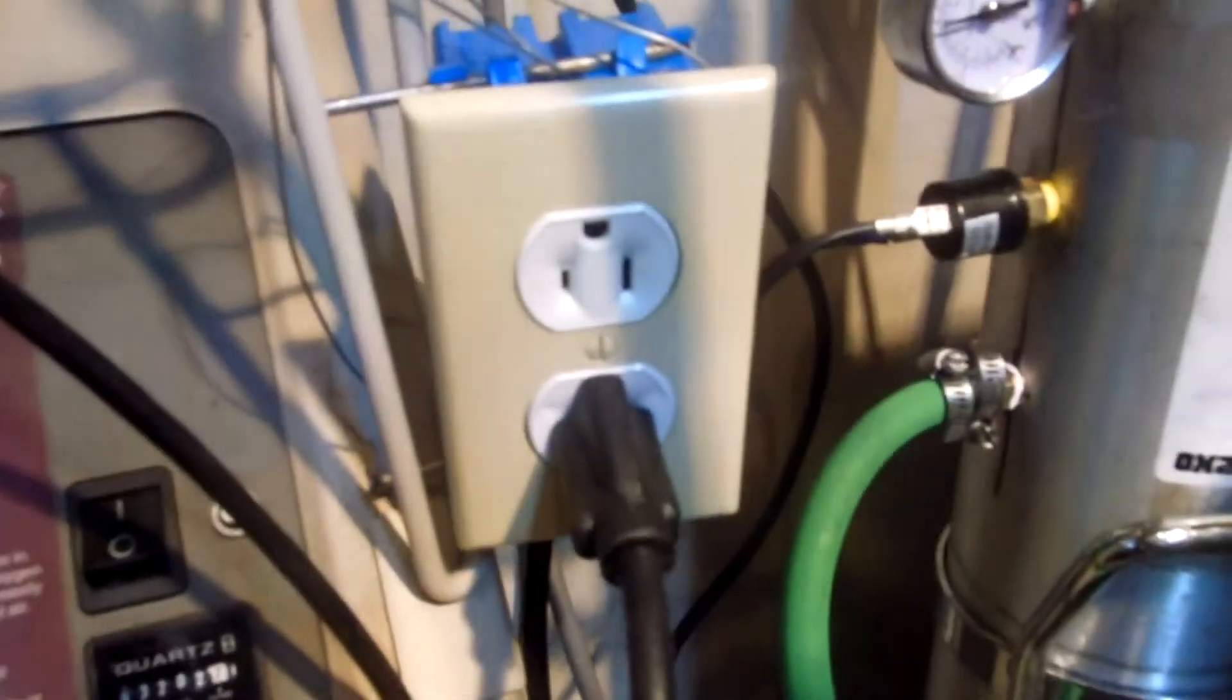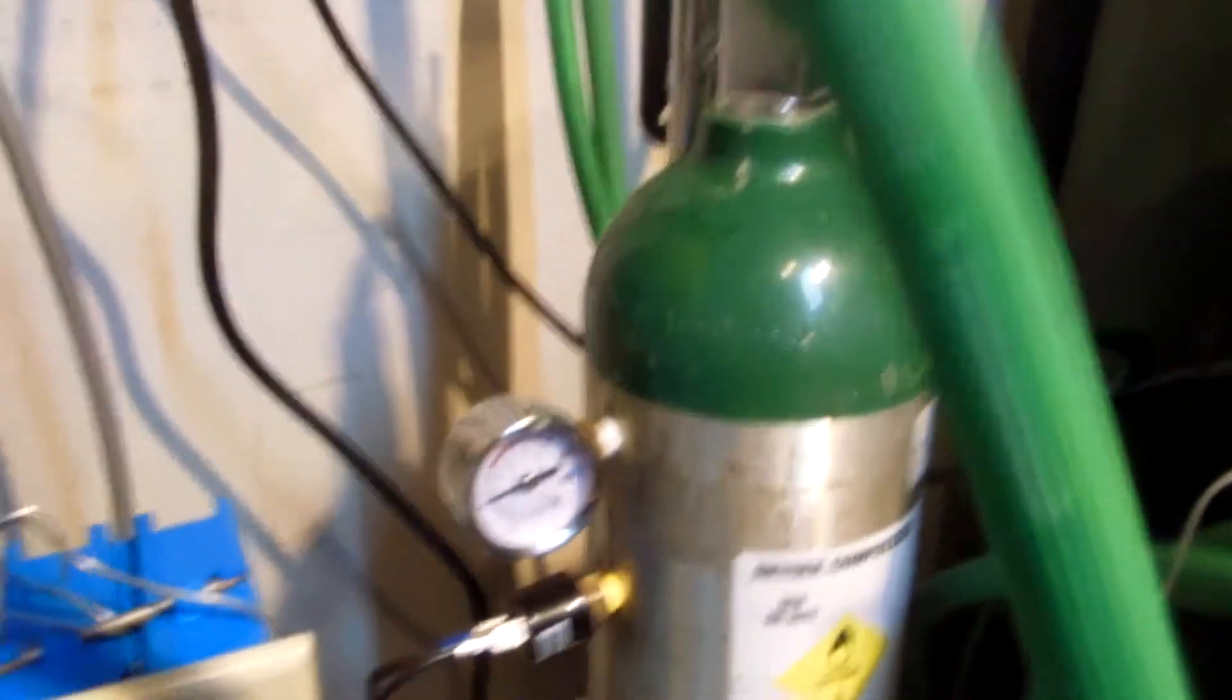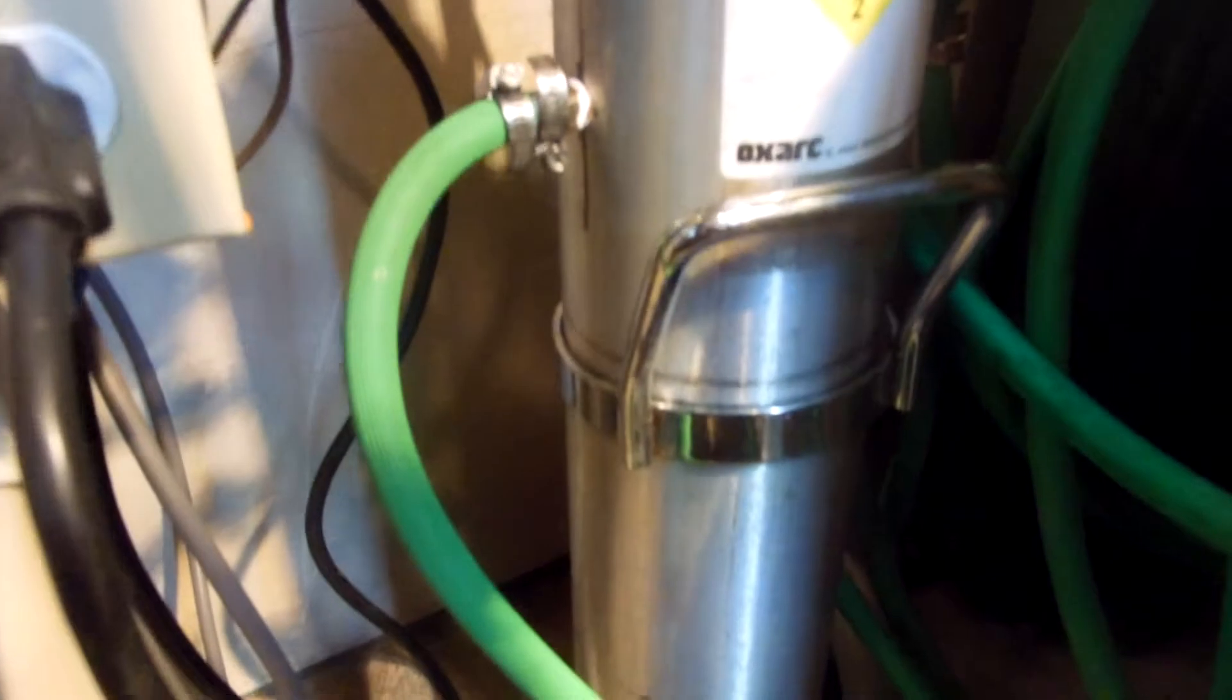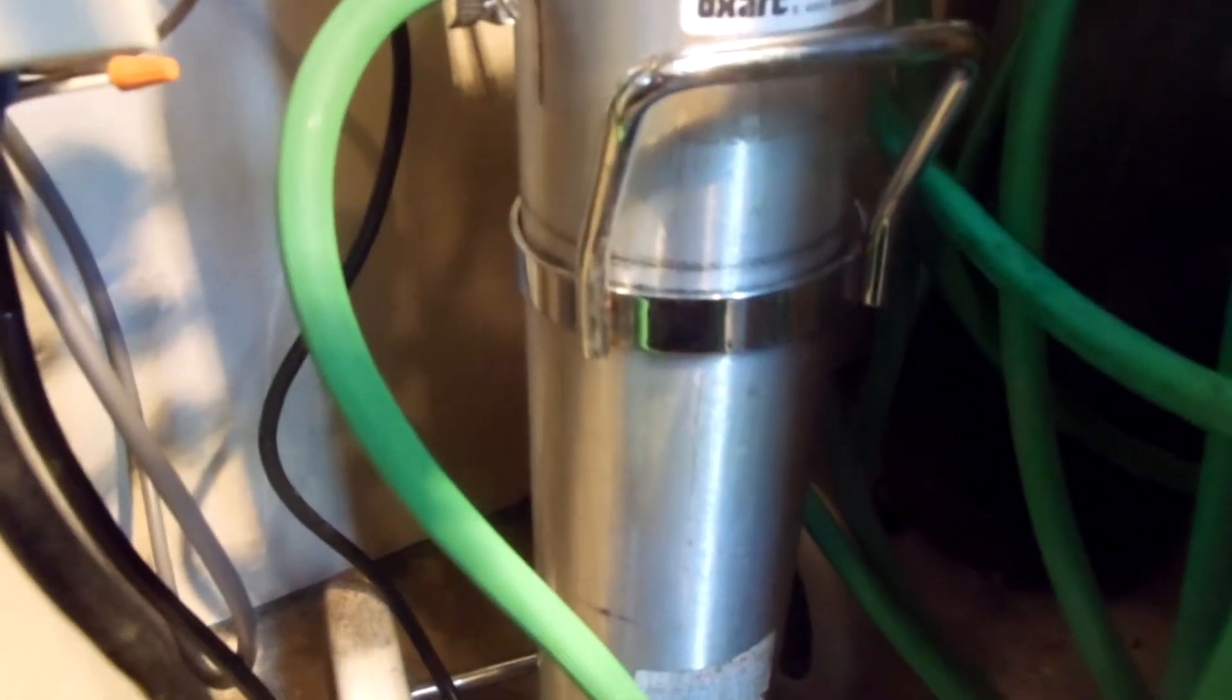And this outlet is wired to this pressure sensor in this little medical tank here. That's my outlet here.